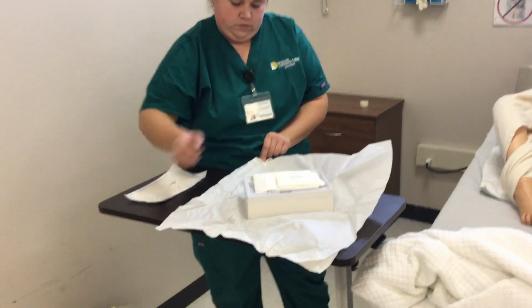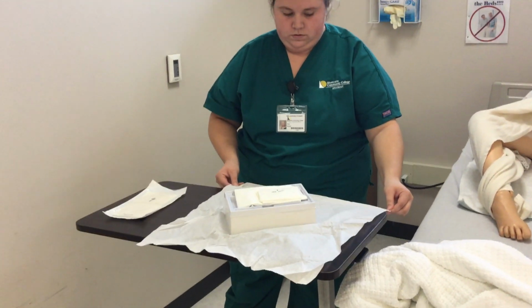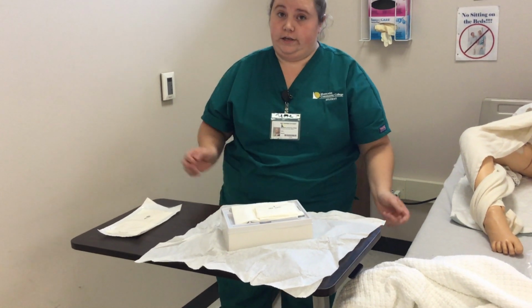So apply the gloves, raise my bed up, make sure the rail is down or up on the side, not working. I'm going to make note that 1 inch around my border is unsterile.